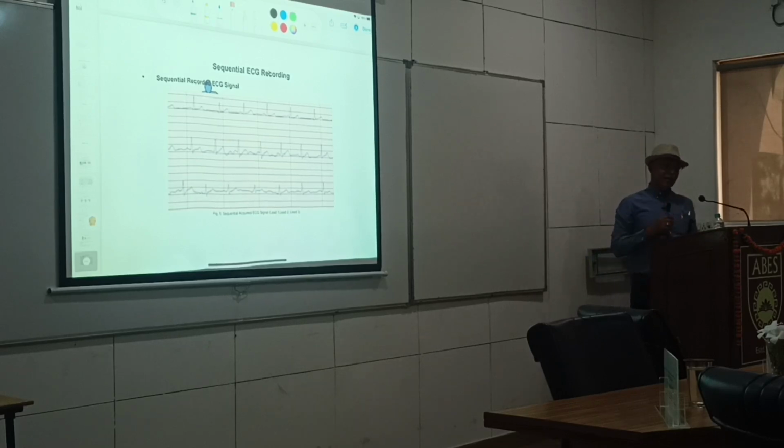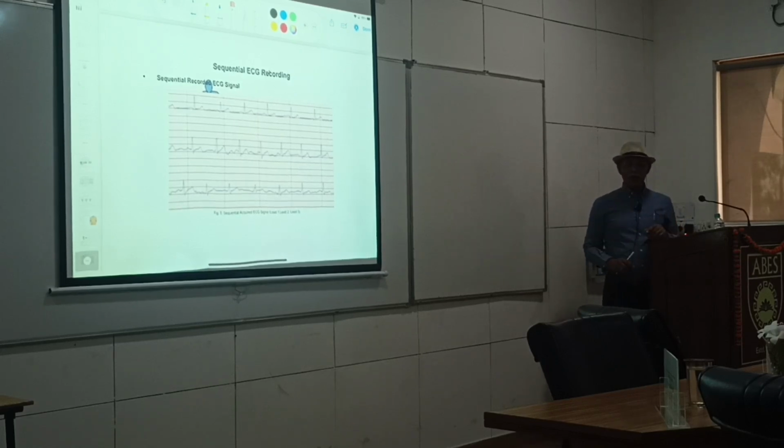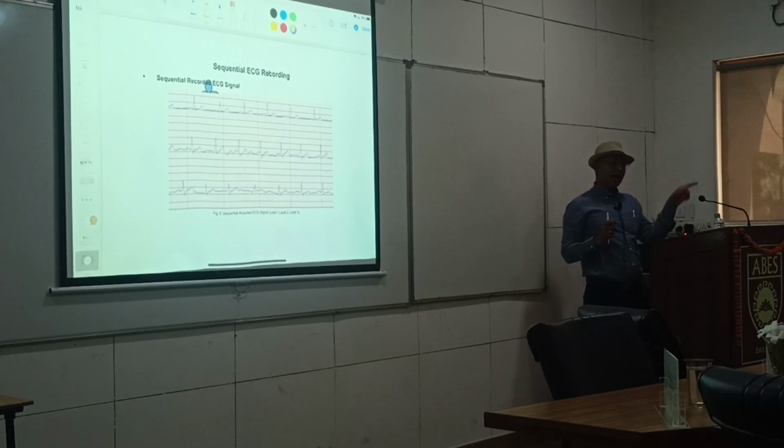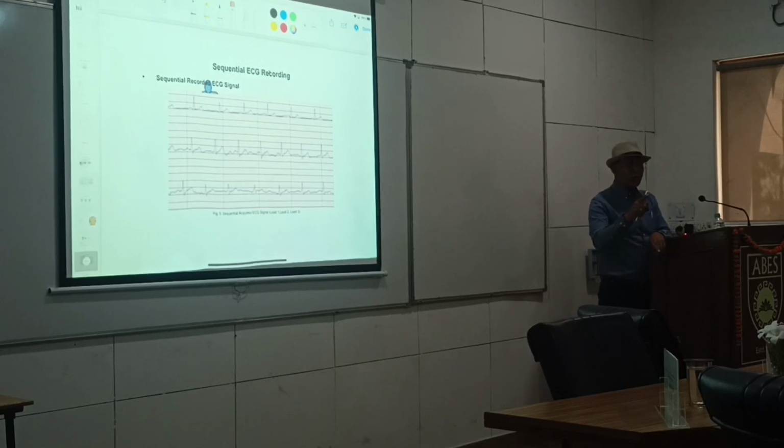What we have done is that you have one pen, this type of pen. You go to the doctor, who is sitting there, and he puts two leads here and one pencil. He moves the pencil on 6 places called V1 to V6, so V1, 2, 3, 4, 5, 6. All signals are recorded there itself and analysis is done. So you need not go from this place to that.